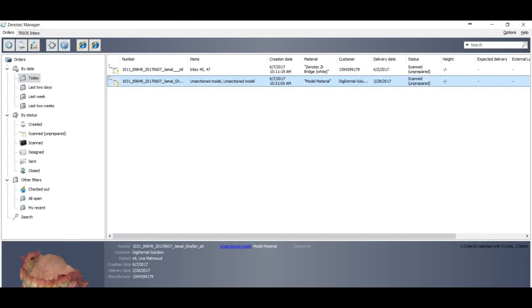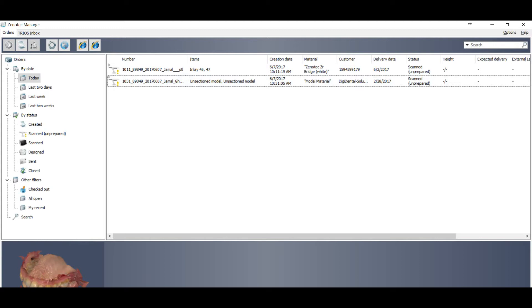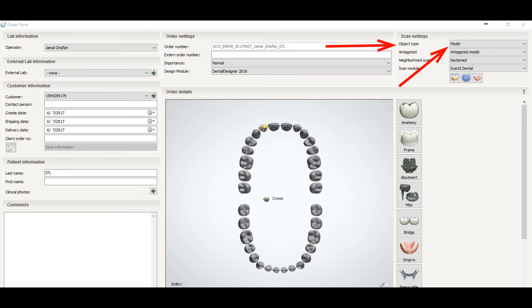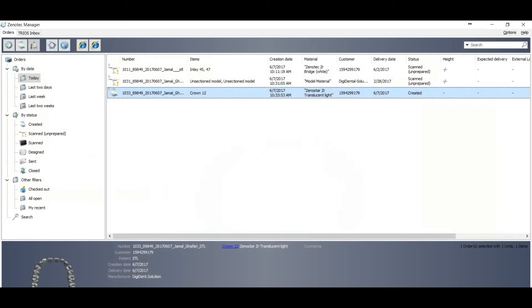Now go back to the dental manager and create a new order. After saving the scans in a folder, you have to create a new order. In the object type, don't forget to select 'Model' — this is important. Press OK. Now we have created one order. Just import the scan that we saved in the folder.